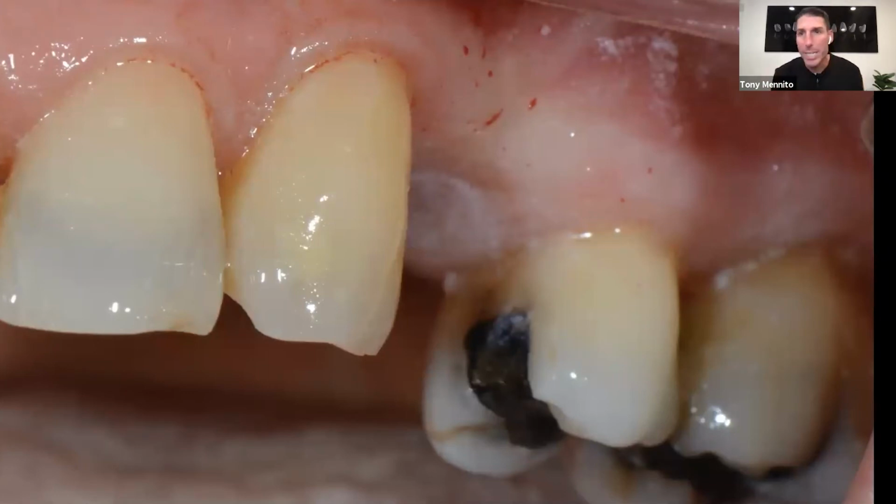So this is a really niche material, and so a case like this where we had a patient who, for financial reasons, she needed a bridge. I think her daughter was getting married, and she was embarrassed by this edentulous space she had that showed when she smiled, but she couldn't afford to pay for the bridge. She had to kind of do it little by little in increments.